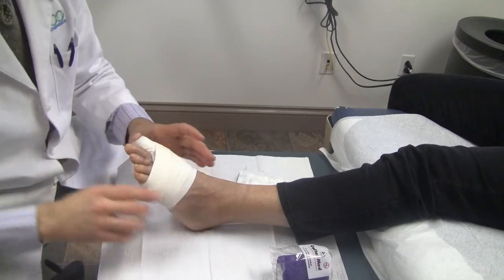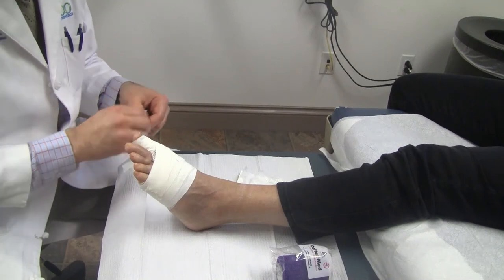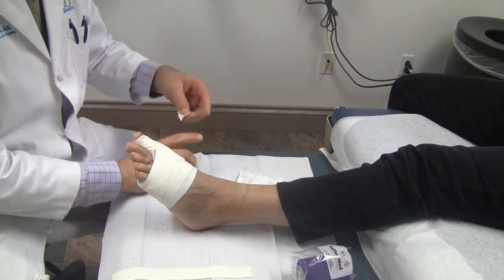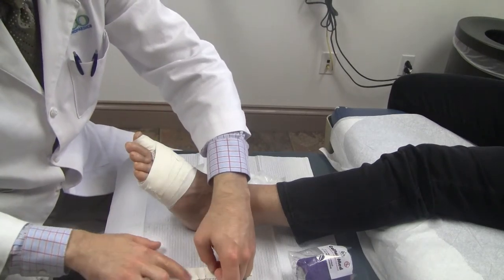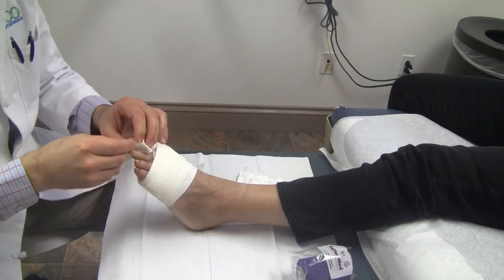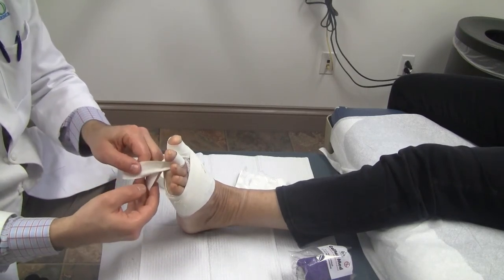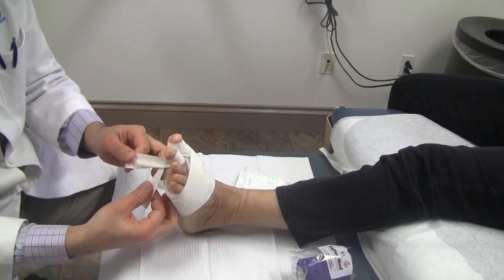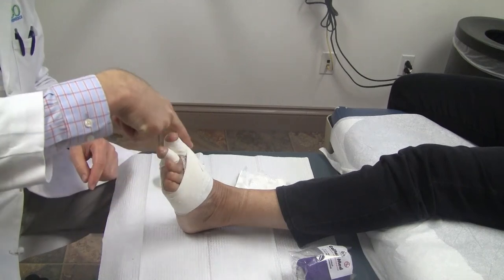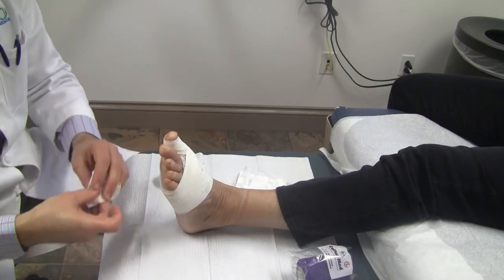We also did some work at her second toe, and your surgery may include second and third toe work or more. If there is a need to do anything at the second toe, tape is brought out to length — about eight to ten inches. A smaller section of tape is torn off and stuck right in the middle, tape to tape, so now it's just pure cloth without any stickiness. This is then lifted up and over the toe that needs to be taped — there's no adhesive there. The foot is raised up and the tape is crisscrossed like a breast cancer ribbon, and you gently pull the toe downward and tape it to the bottom of the dressing. An additional strap would then be wrapped around to hold the tails on. Her toe doesn't actually need the second toe dressing, so I'm going to take that off — it was for demonstration only.